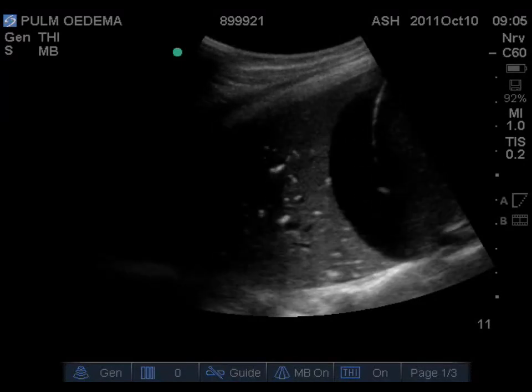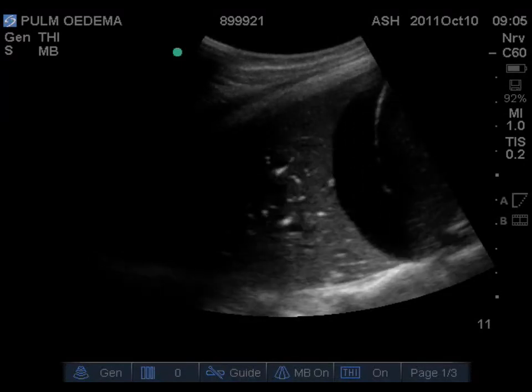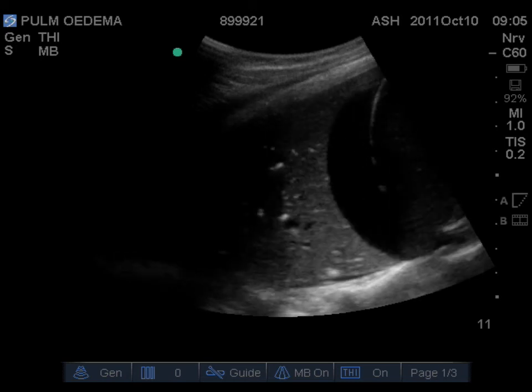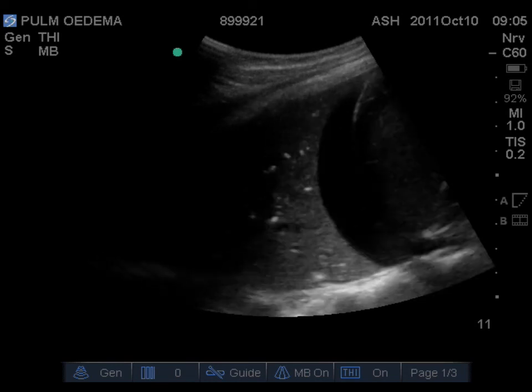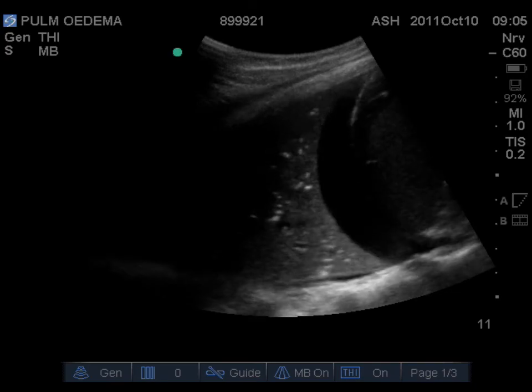So here's another example of hepatized lung with a small pleural effusion. We've covered lung sliding, A lines for when there's dry lung, B lines for when there's wet lung, and C profile, that's to say consolidation profile, which can either be fully hepatized lung or just before that stage, shredding.